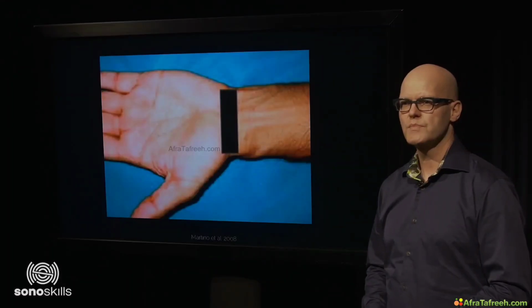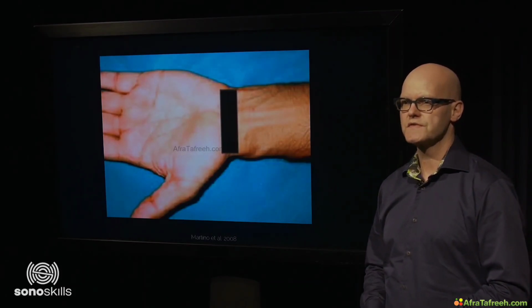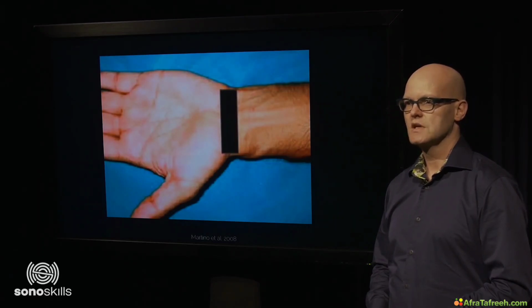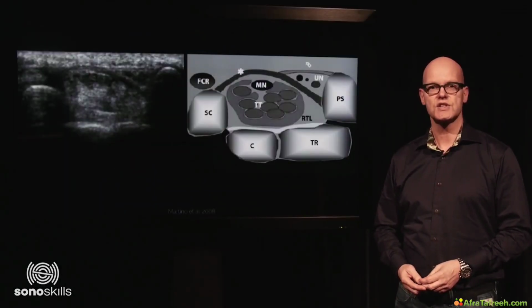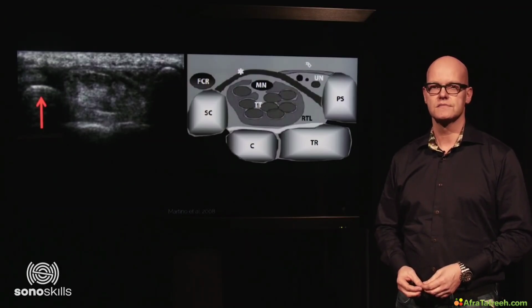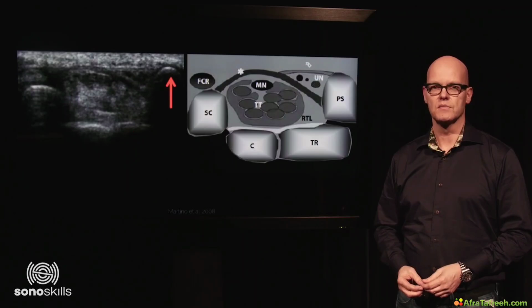To scan the proximal part of the carpal and ulnar tunnel, place the transducer transverse in short axis on the proximal row of the carpus formed by scaphoid, capitatum, triquetum and pisiform bone. The osteology of the proximal carpal row in the ultrasound image can be seen as hyperechoic lines with acoustic shadow underneath. The scaphoid, the capitate bone, the triquetrum and pisiform bone.